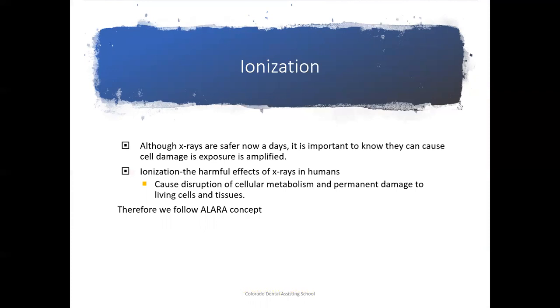What do we know happens whenever we have any disruption to cellular metabolism? It could cause cancer, right? That's why we follow the ALARA concept. So as low as reasonably achievable means that for every single patient, we will have an individual treatment plan, and the doctor will decide whether or not they need x-rays. We aren't going to say, well, every year we have to take your bite wings because the American Dental Association says we have to, so we're going to do it anyways.